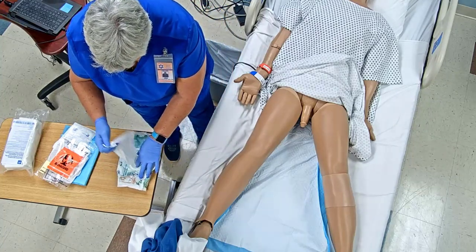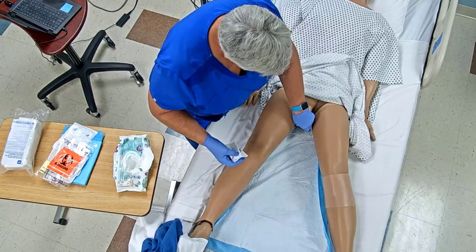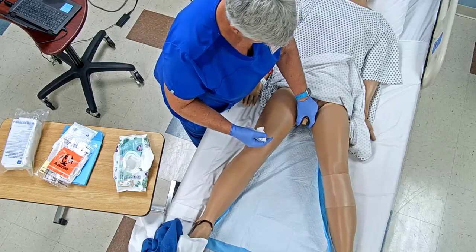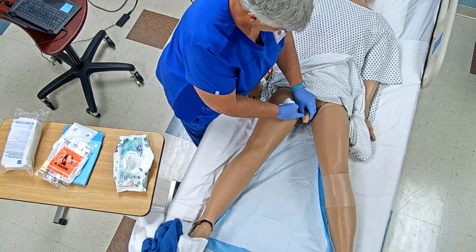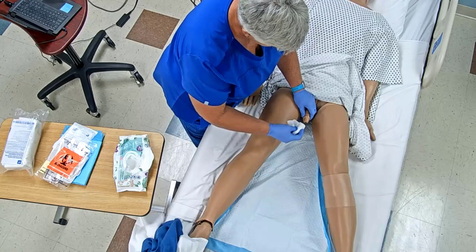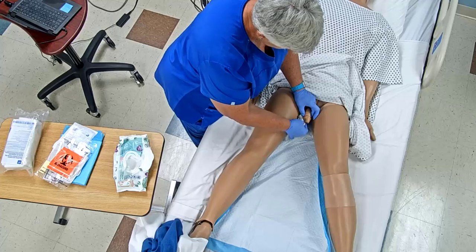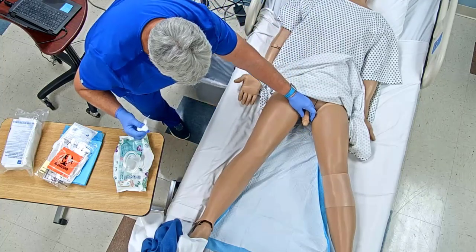With this, if our male was uncircumcised, we would pull that foreskin back. That foreskin comes back to the glans here. And we're going to take our first washcloth and start at the meatus and work in a circular motion to the glans. And then I'm going to get another one.